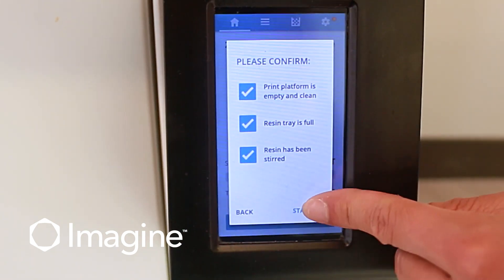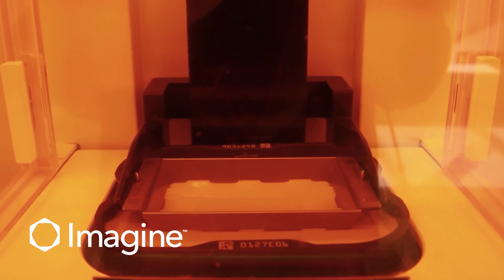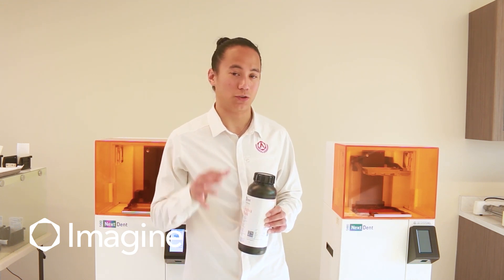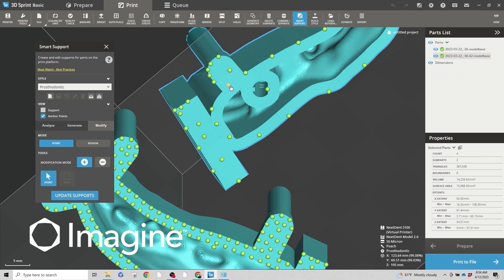After confirming all three items, we'll click start job. As our models are printing, we're going to go ahead and start the printing process for the gingiva mask as well. An important thing to know when nesting your gingiva masks for your models is that you attach the smart supports to the tissue surface of your gingiva mask and not the model surface, to ensure an exact fit.